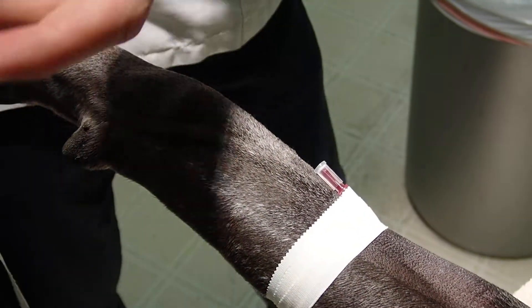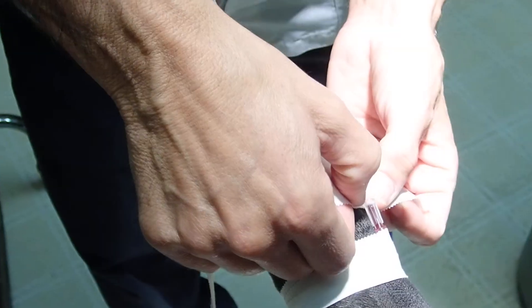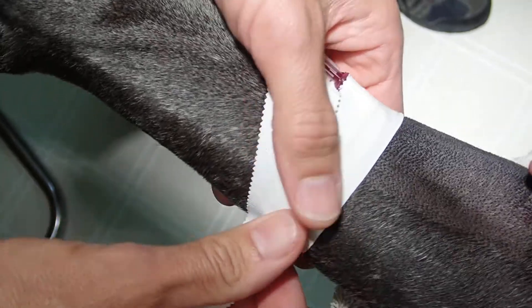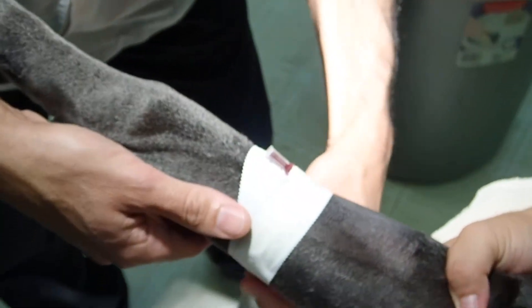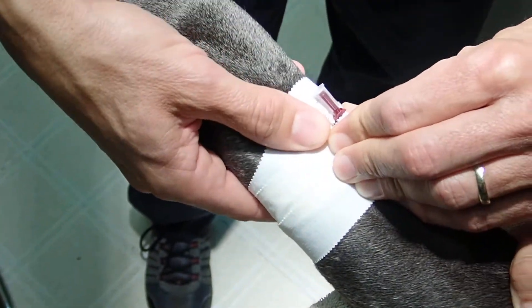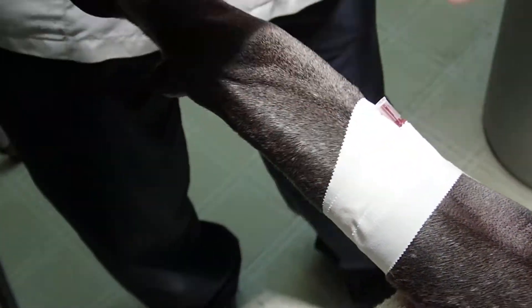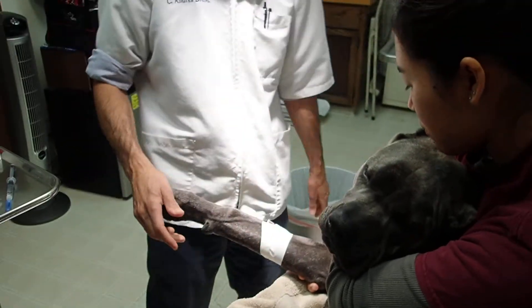Then I'm going to take my one-inch tape — I don't make any other tears on this tape. I'm going to put it sticky side down, leaving about four or five centimeters on my left side. I'm going to orient this cranially so there's a slight bend in the tape, so that when I go around it's right over the hub of the catheter. Then I go around again halfway as if I'm bandaging. I'll mold it — this is essentially what holds down the catheter. Notice I didn't put the T-port on initially; you could, but I prefer not to because it always gets in the way of your taping. So I don't put the T-port in until this point.